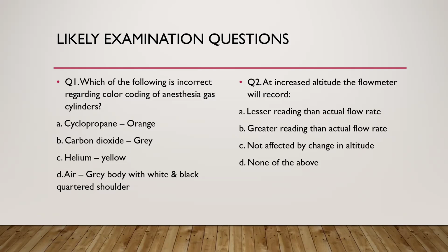Lesser reading than the flow rate. That's A. That is Irene. Yes, Irene, correct. Lesser reading, okay? And that will give your patients an overdose of your drug. We're going to be looking at that as we go on in the course of the discussion.